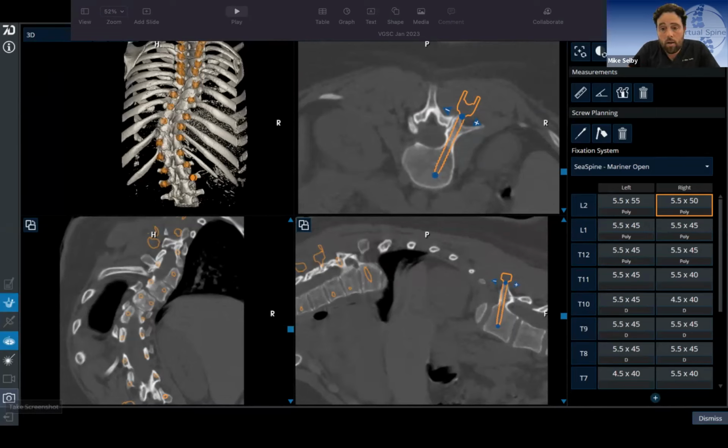Screws at the moment in Australia either come in screw banks or pre-packaged individually. Screw banks are awesome, but there are concerns about sterility and reusing. I have seen some studies on bank screws that are continually washed, and contamination and potential low-grade infections.